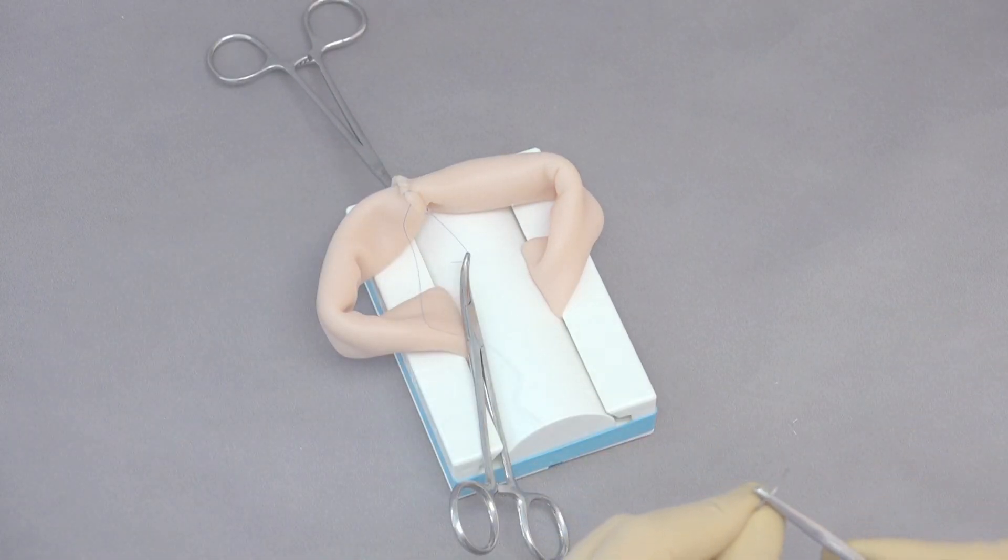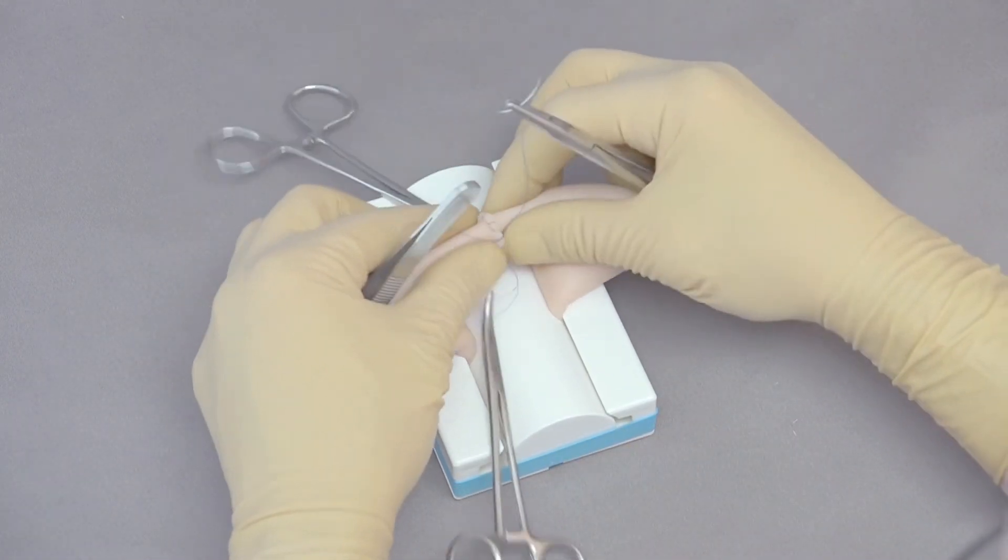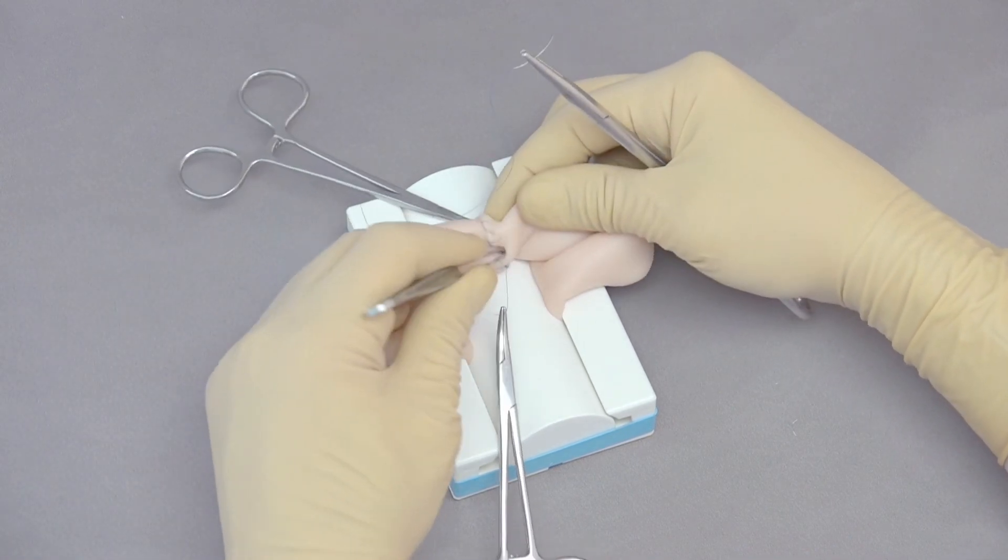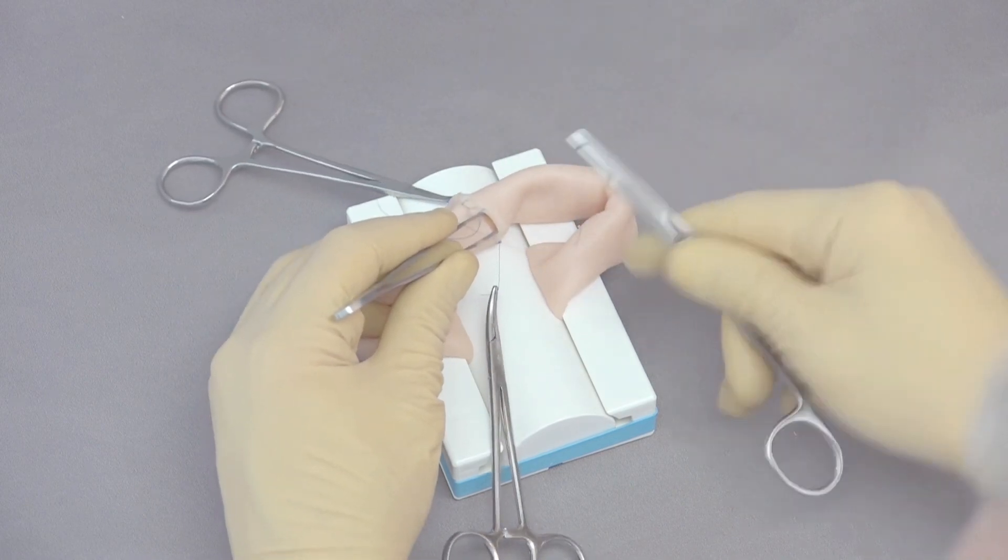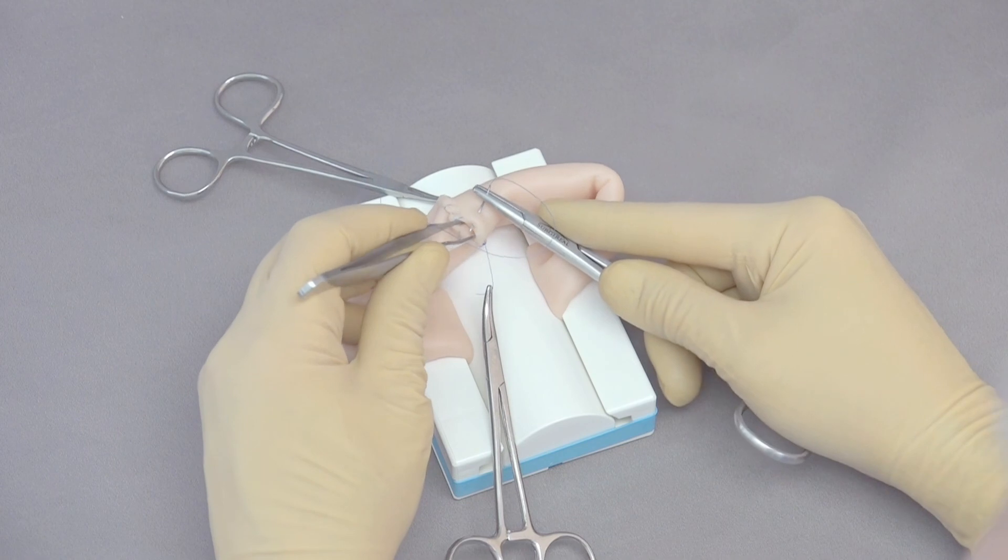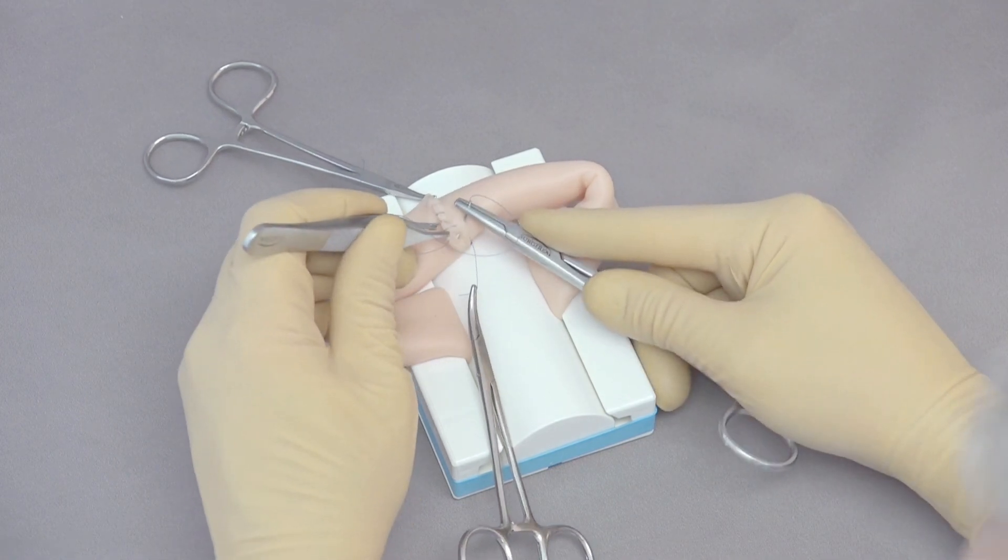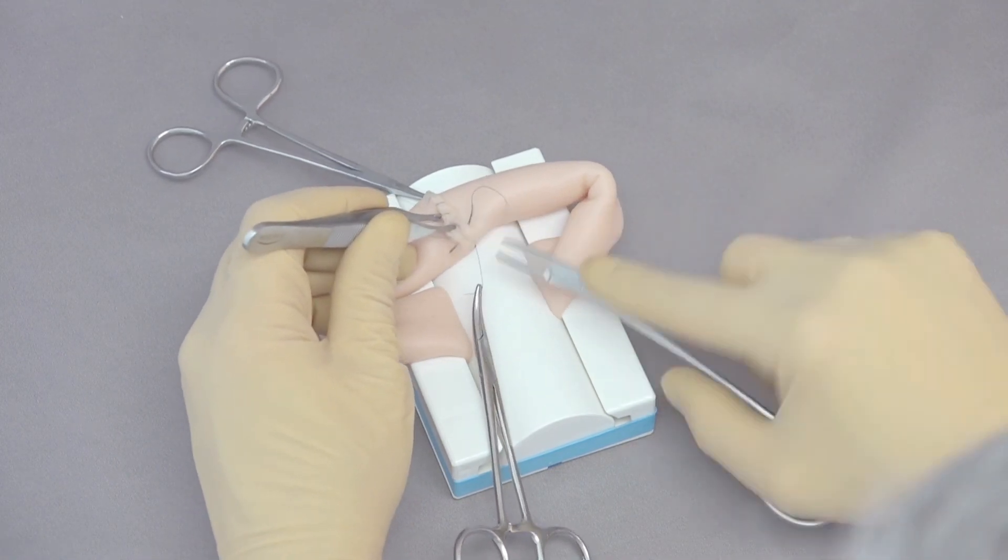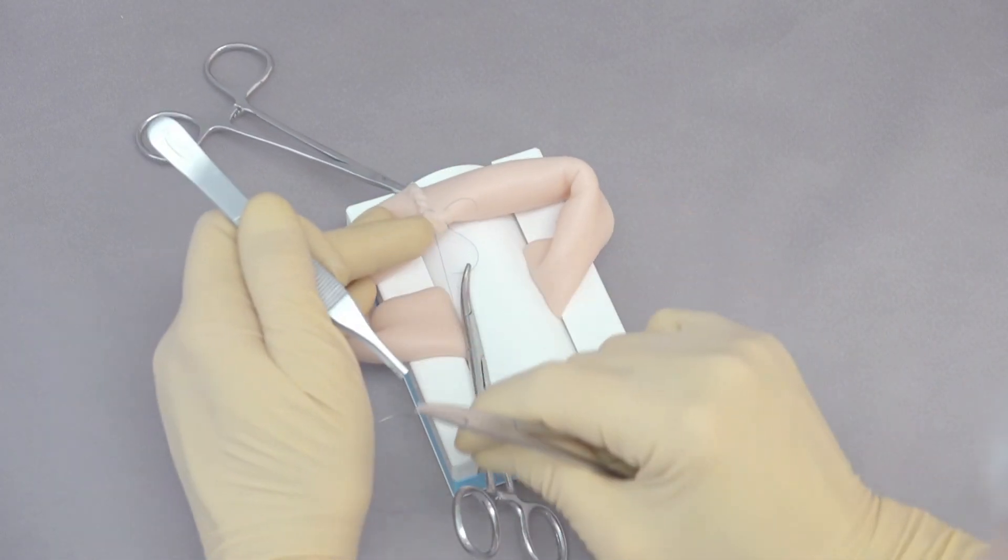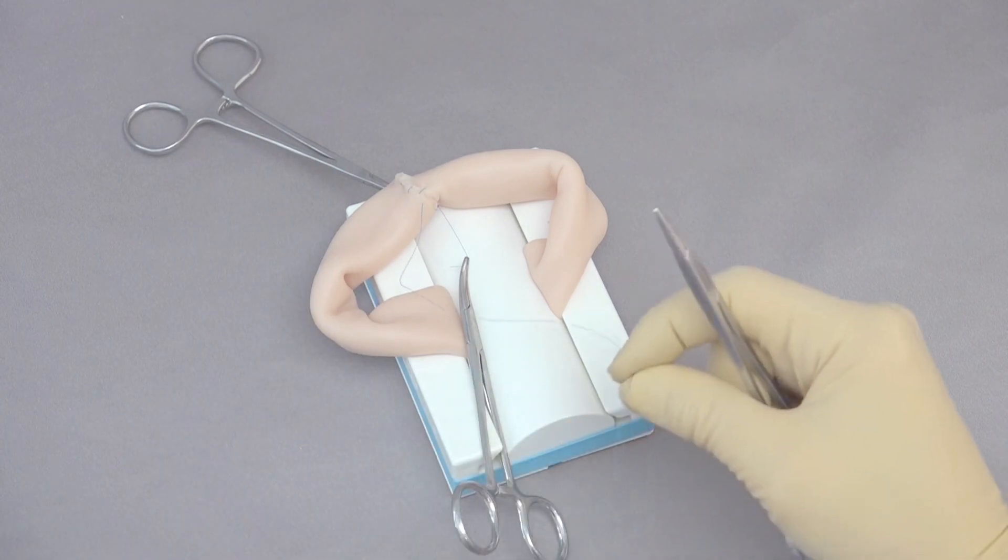As we get close to finishing up this we can look at it and make sure that we're going to use our thumb forceps again to stabilize because we don't want to get the opposite side of the bowel. So we put the thumb forceps in here, stabilize, hold that open, look at the other side and do that. Then we're going to take one more bite and that should close this just fine, tensioning that down.